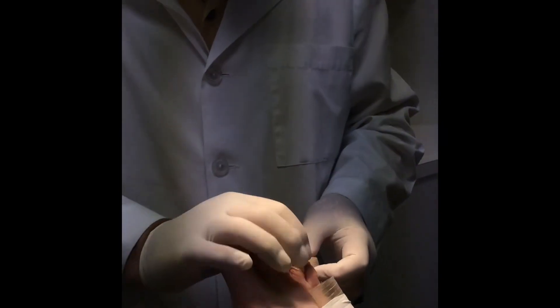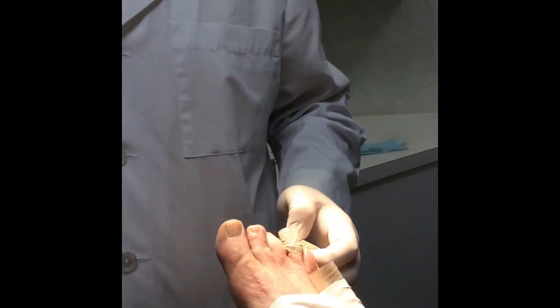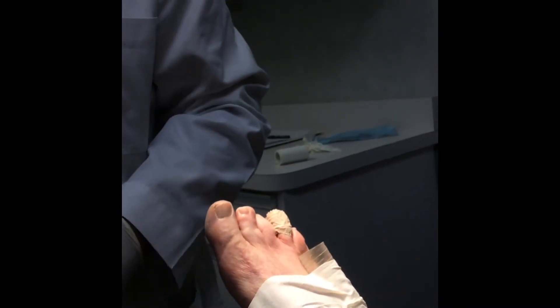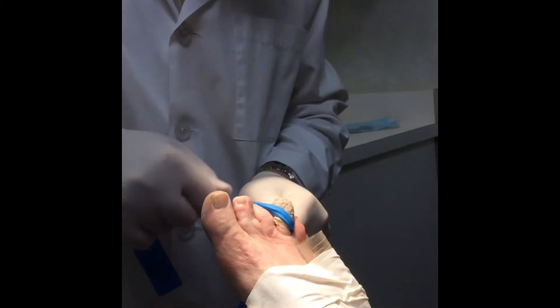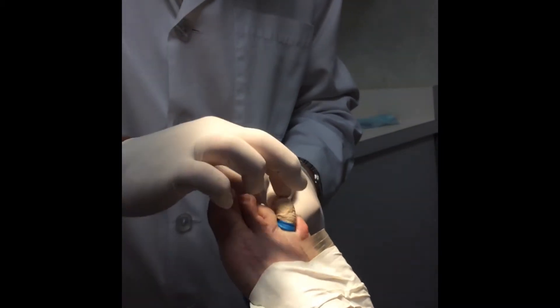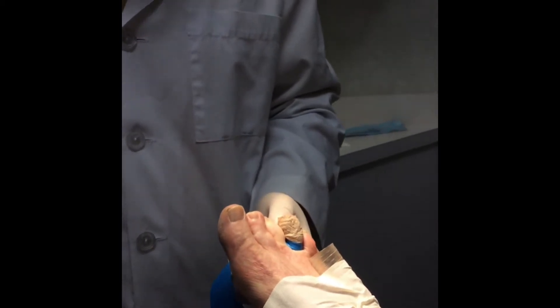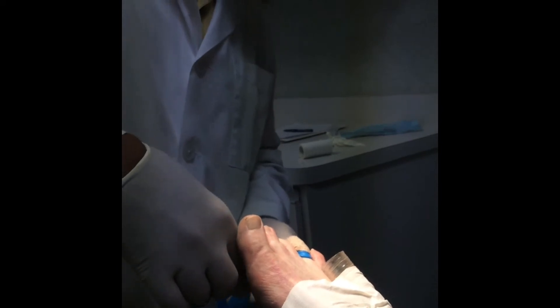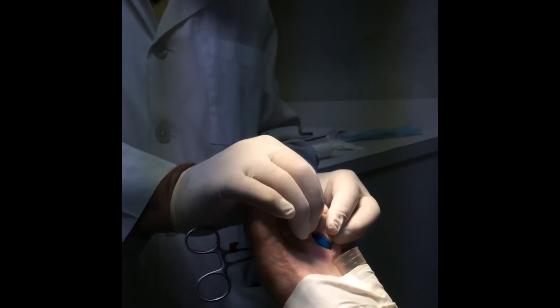Right now I'm applying a little coband to the area to exsanguinate her blood. We have attempted many times to take care of her fungus of her nails. She's had other lasers that have tried to eradicate the fungus nail, but that has not worked. So we are just going to excise the root permanently and she'll never have a nail coming back again.